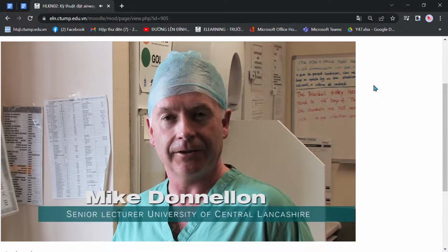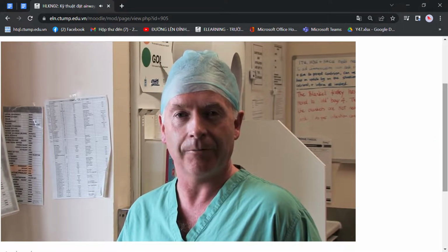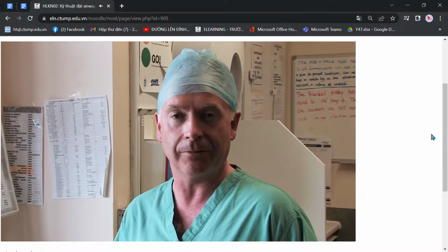I'm a senior lecturer at the University of Central Lancashire. This short video demonstrates airway management techniques and the potential complications.